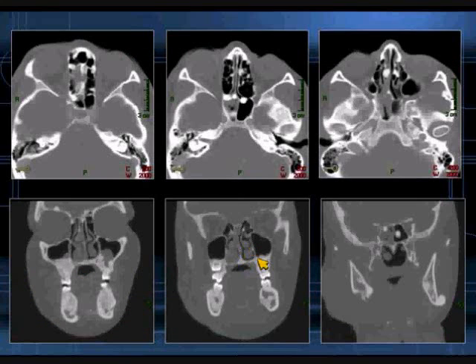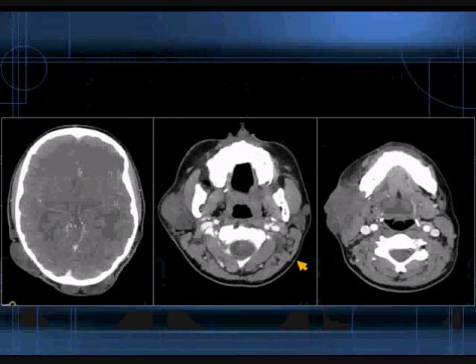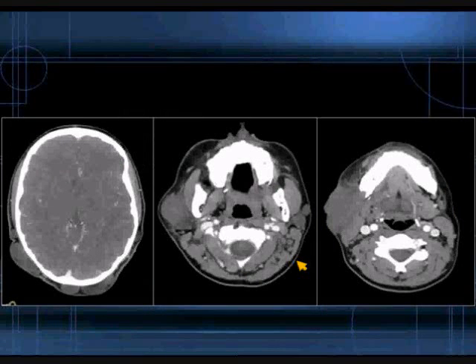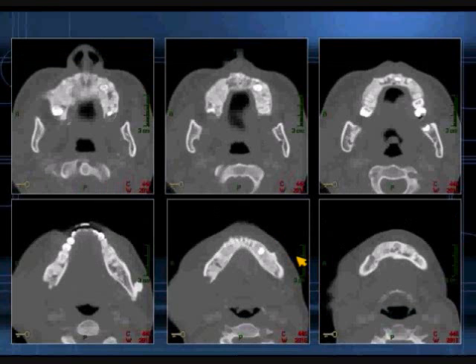Here are some representative axial as well as the generated coronal reconstructed images. And here are some images from the patient's head and neck CT examination, with more axial sections of the lower mid-face.